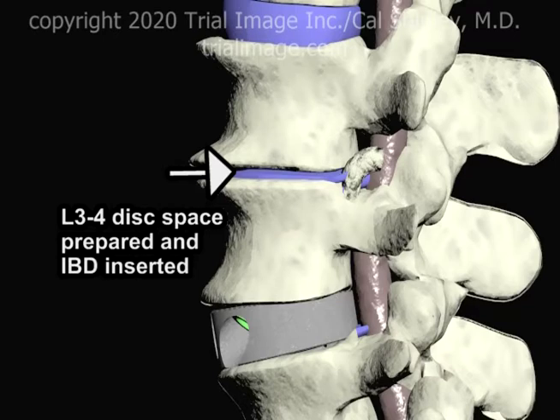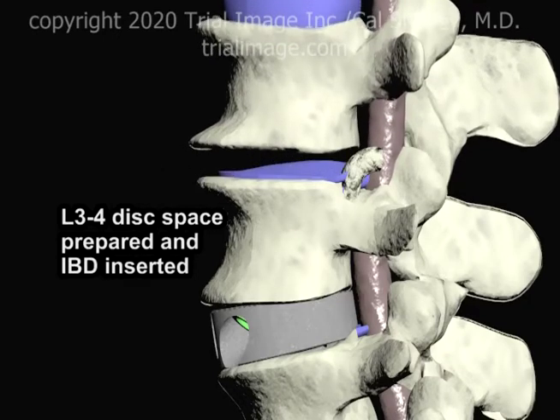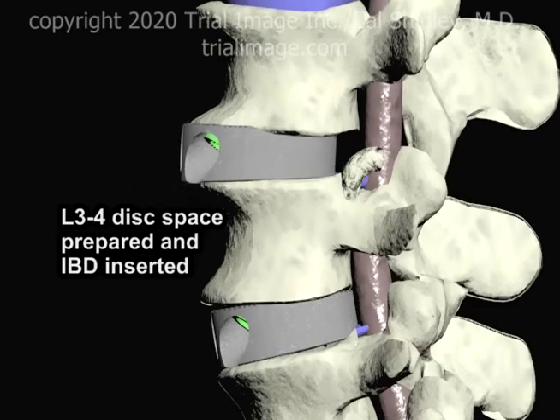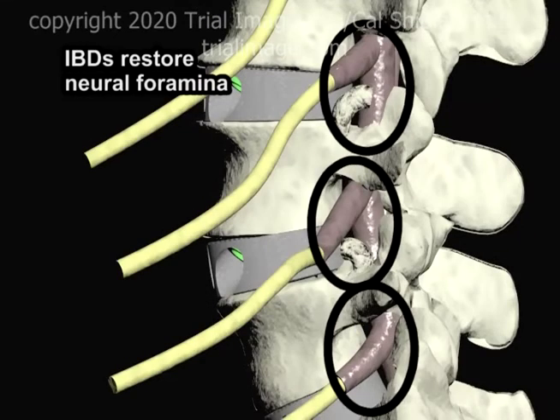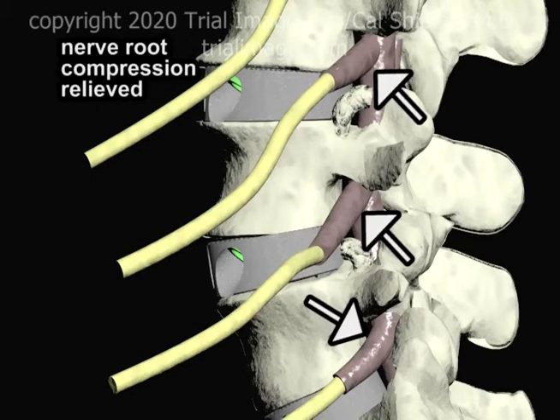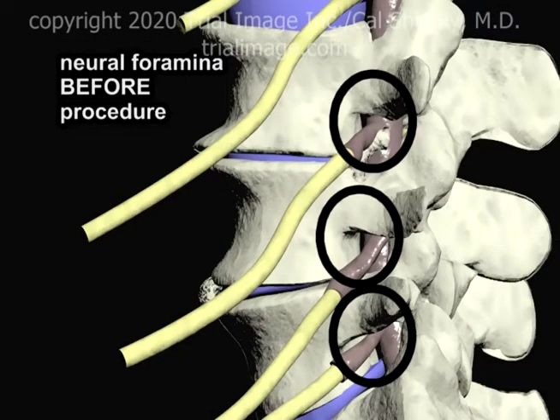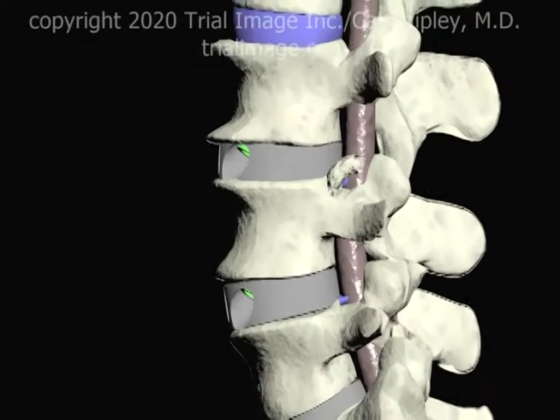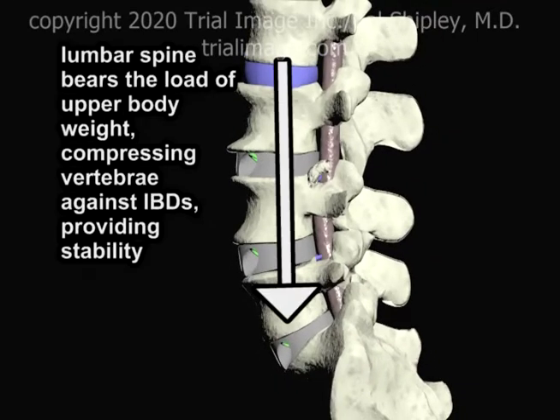The same technique is used to place an interbody device at the L3-4 disc space. The ALIF portion of the procedure is complete. The placement of the interbody devices restores the openings of the neural foramina and relieves nerve root compression. The lumbar spine bears the load of the upper body weight, compressing the vertebrae against the interbody devices and providing stability.